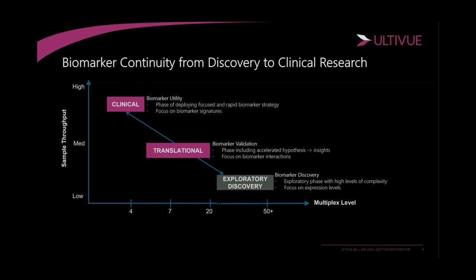Now, whatever you discover from that exploratory phase, now you need to validate it. So it's a phase where you're going to be doing a lot of accelerated hypothesis testing and collecting those insights and making sure that this biomarker has a level of robustness around it. So it's now changing the focus onto biomarker interactions and cell-to-cell interactions and trends. The multiplexing here is naturally going to decrease because you've identified those biomarkers you want to focus on from your exploratory discovery, and naturally your throughput needs are going to increase as well.